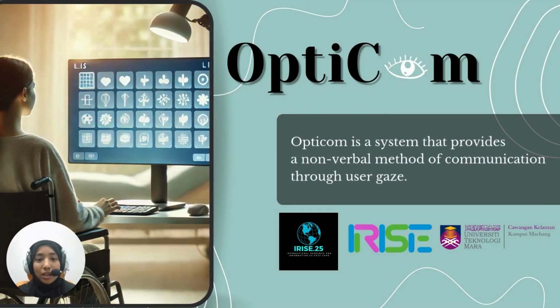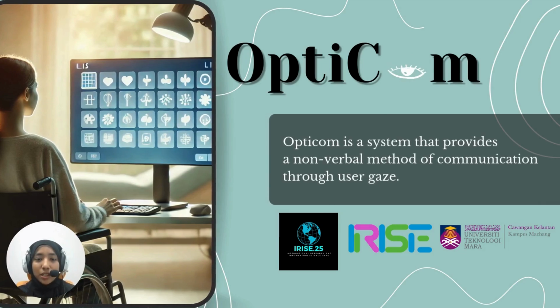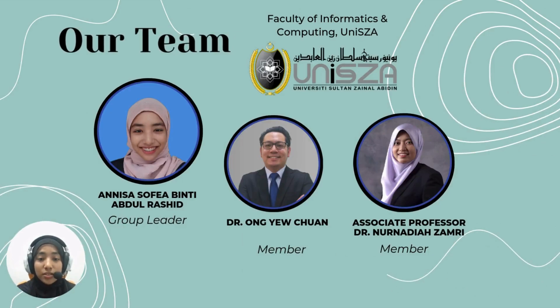Assalamu alaikum. Allow me to introduce OptiCom, a system that provides a nonverbal communication method by using the gaze of a user. Introducing team members, my name is Anisa Sofia binti Abdurrashid.